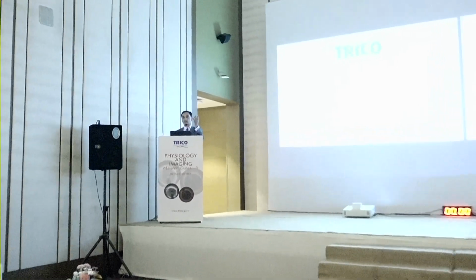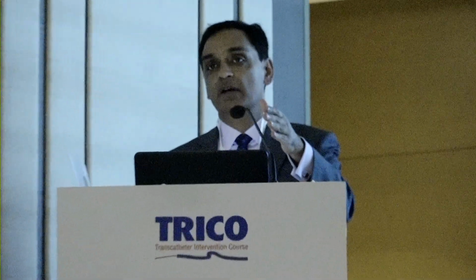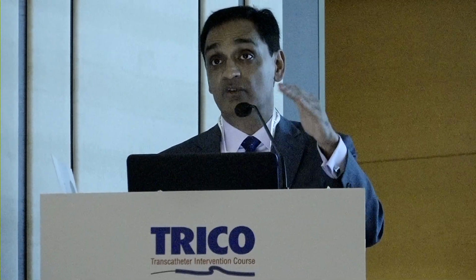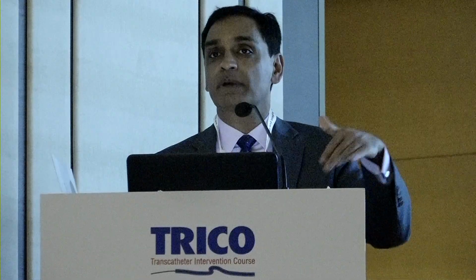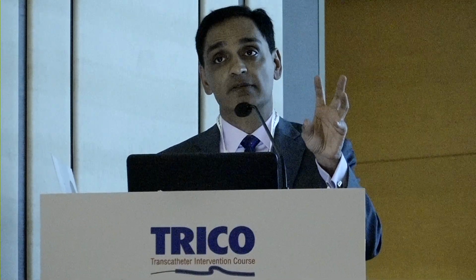You're done. Because the only concern would be, is there a problem with the stent? If there's no dissection, no issues with expansion, it is because of diffuse disease. That's why you're getting it. And that's why it's never been used for optimization, because early on when it first came out, there was this thinking that we should be using it. It comes up as a topic every so often, studies come out every so often, but it's never been shown to be clinically useful. I would go by imaging to optimize stents.